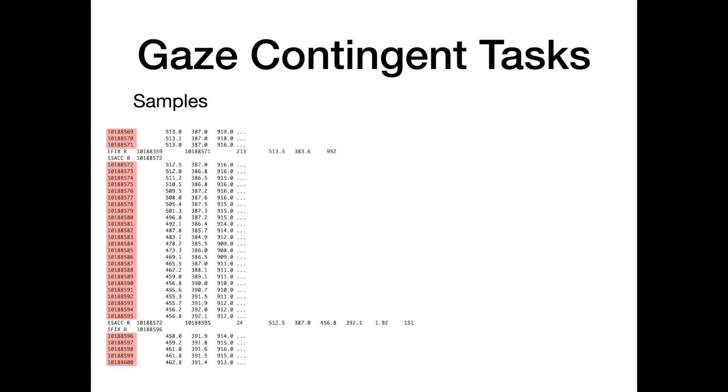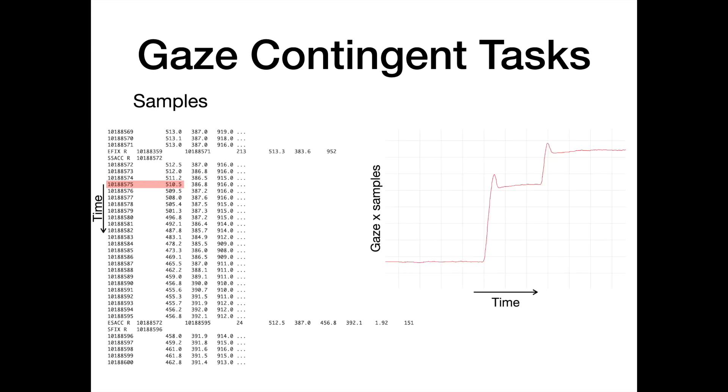This is the raw data file converted to ASCII. The left column represents a timestamp every millisecond and every millisecond we have a new sample which generally consists of gaze x and y position as well as pupil size.